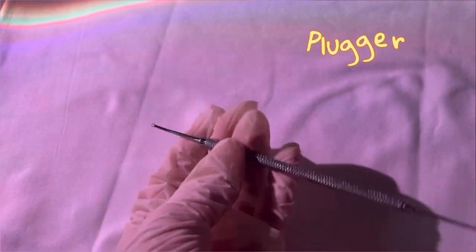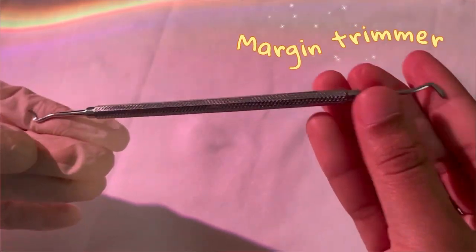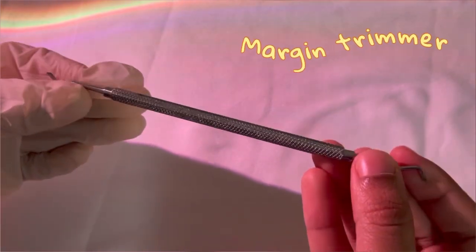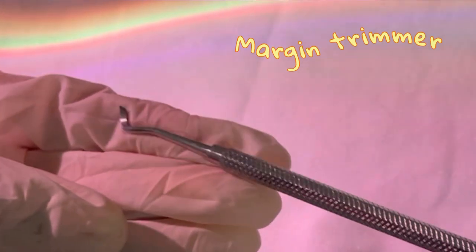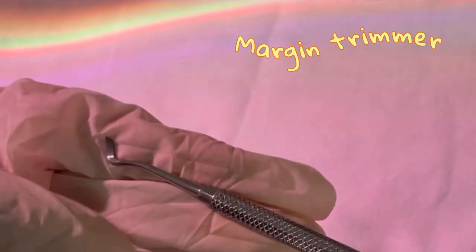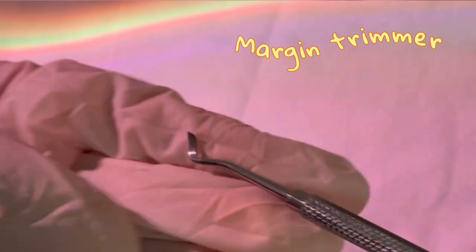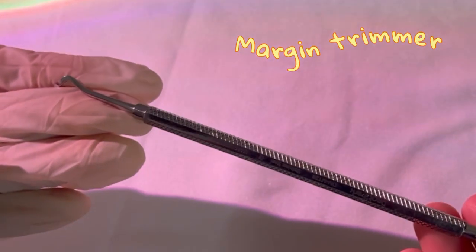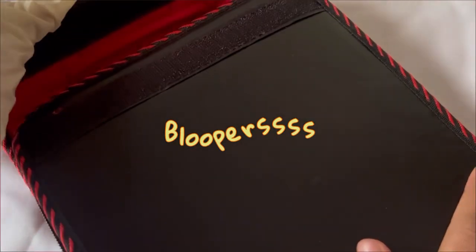Lastly, this is a margin trimmer, also known as a gingival trimmer. Both sides almost look the same. It is a cutting instrument used to trim the enamel and create a bevel on the enamel surface — a bevel being a slope. So this is used for creating a slope on the enamel surface.